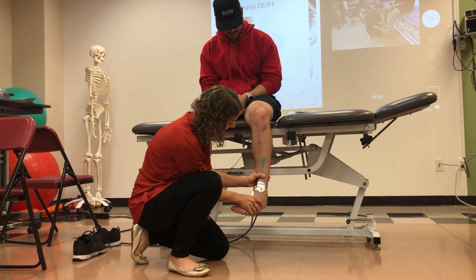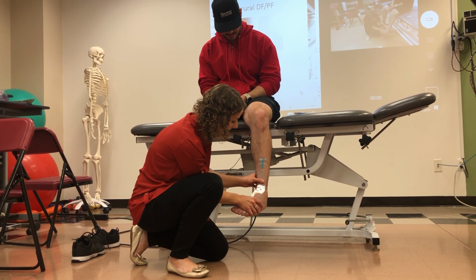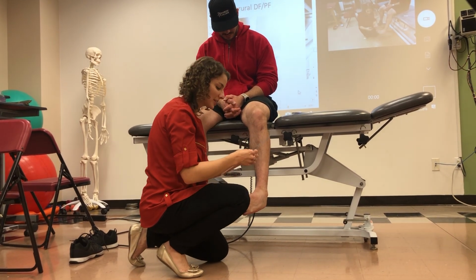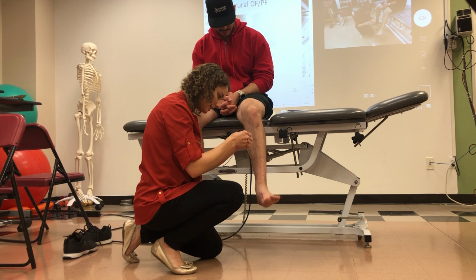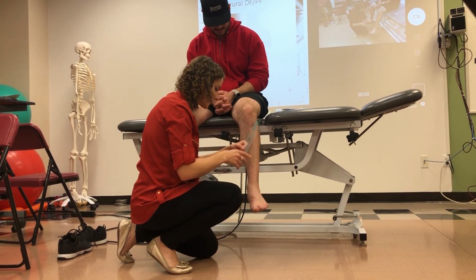So you can see because it's a flexible goniometer, it's just nice to be able to keep it stable on the landmarks versus something that's more stiff. It's going to be much more challenging to take that measurement. And then he measured at about 32 degrees of inversion.